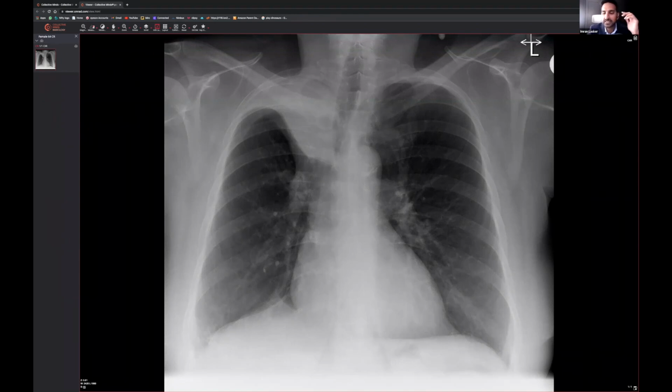the phrase is CRMO. Let me just quickly look it up for you. Chronic recurrent multifocal osteomyelitis. And it's not necessarily infection that's caused it, but you can get multiple areas and can come at different times and stuff like that. So that particular patient had very similar appearances to their shoulder, actually.